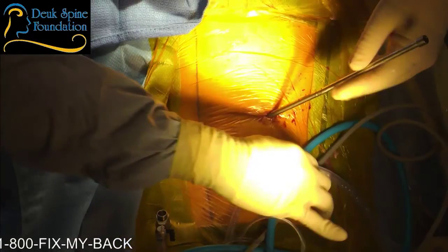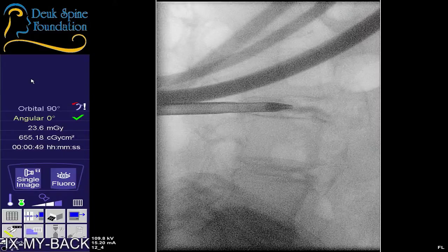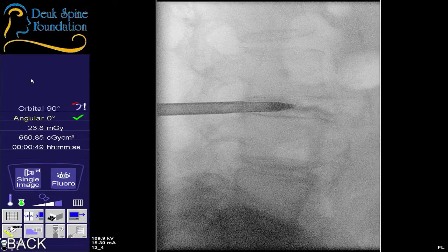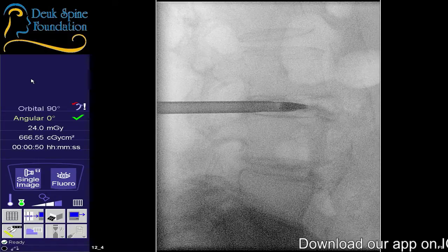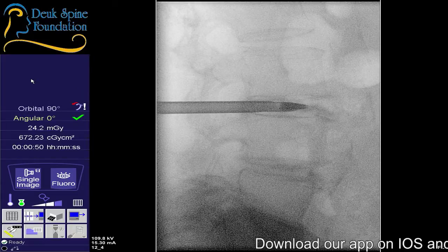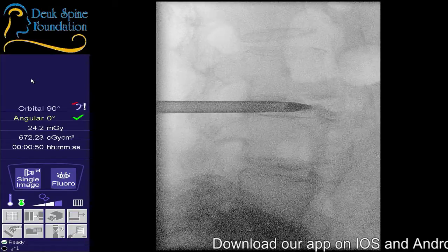As I do this, I don't want to advance the dilator. And I don't want the dilator coming back either towards me. I want to advance my tubular retractor over the dilator. Beautiful. So we'll be done in 10 minutes.